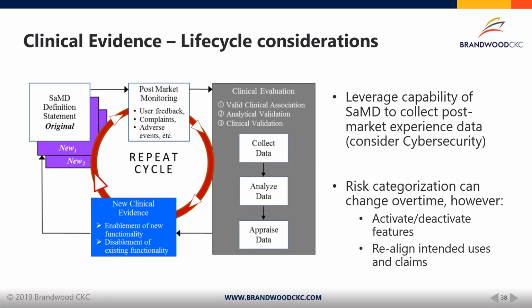So what that means is that through this post-market phase, as you review user feedback, complaints, adverse events, and ways that the device is actually used, you'll be collecting this data, analyzing the data, and reviewing whether your clinical evidence needs to be supplemented or is still valid as it stands. You typically have 2 options there. Well, first of all, as you review this data, you need to see if the original intended use of the product is still valid or if this has to be modified.